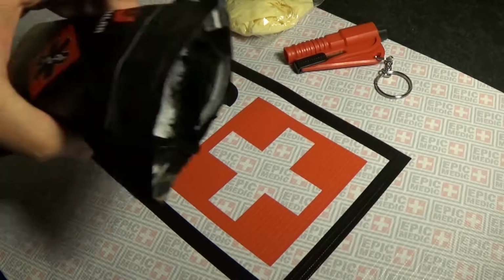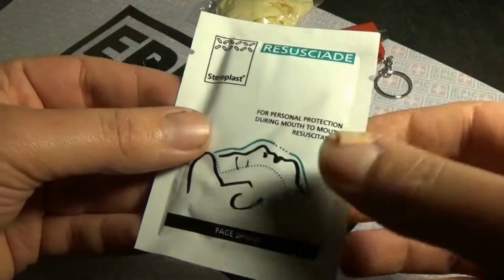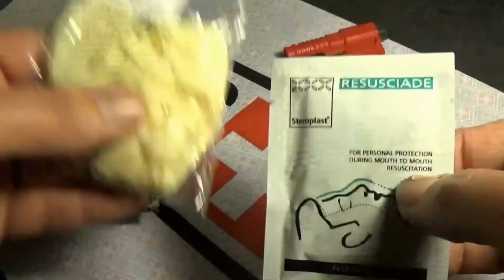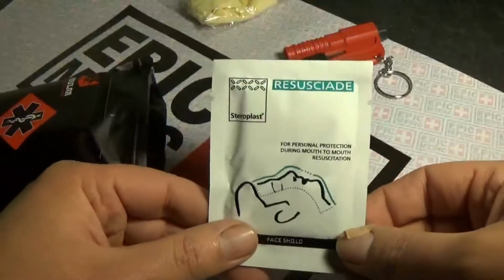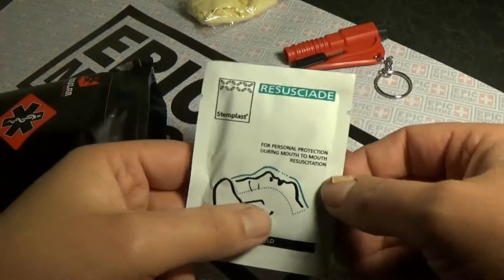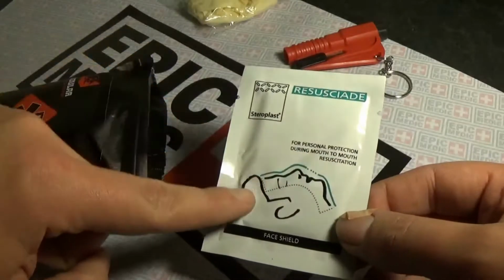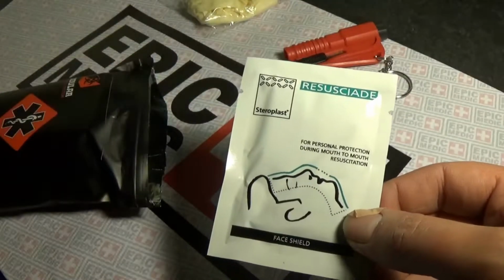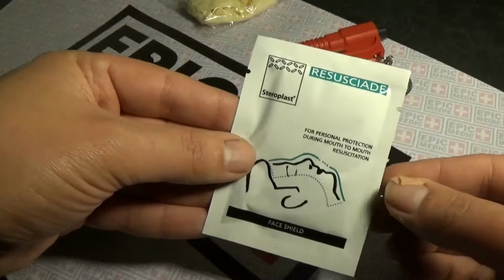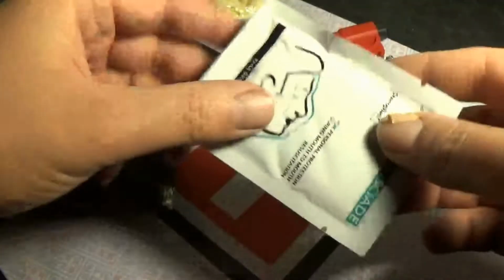Okay, we have a CPR Face Shield. So again, going along with the cross-contamination theme. If you have to give someone CPR, maybe they've lost enough blood or perhaps there's another issue going on. Again, you want to reduce that cross-contamination. So having a decent face shield like this basically removes that skin to skin and allows you to give the person mouth to mouth whilst reducing the risk of cross-contamination. So nice and small, doesn't add any weight or anything to the kit, so definitely a worthy addition. So CPR Face Shield.